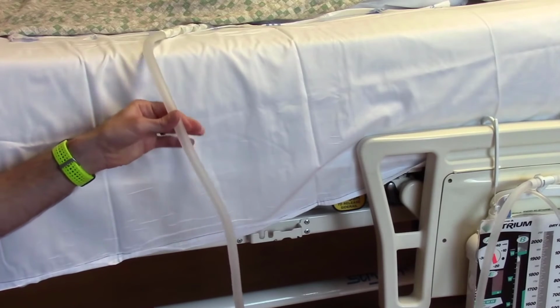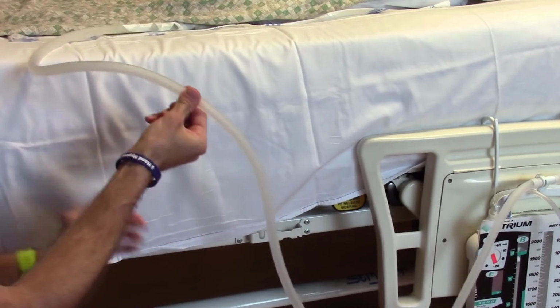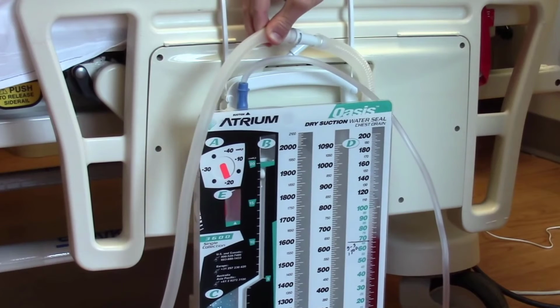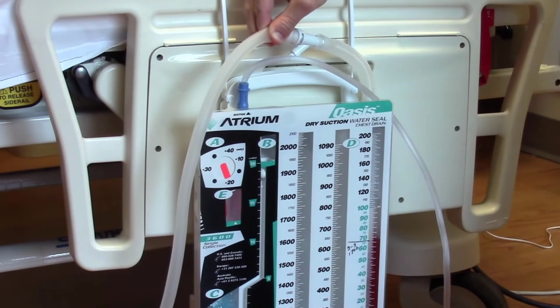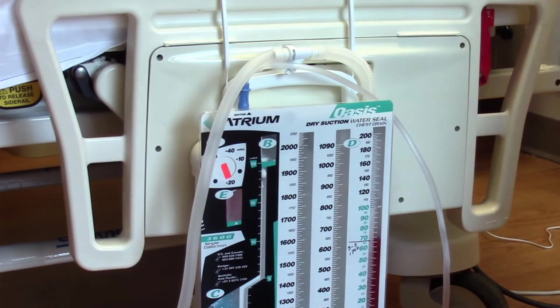If bubbling continues, move down the tubing and clamp about every 12 inches or so to identify the source of the air leak. If you get all the way to the drain itself and clamp and still have bubbling, you know the air leak is in the chest drain itself. You'll need to go ahead and switch out the chest drain. Keep in mind in this whole process when searching for the air leak, never clamp the tubing for more than a couple of seconds or you risk a tension pneumothorax.